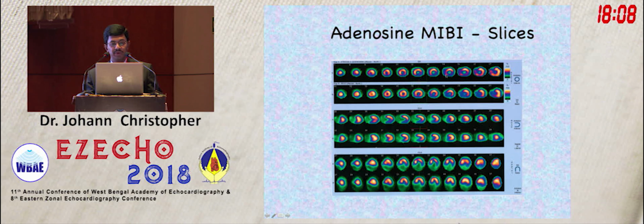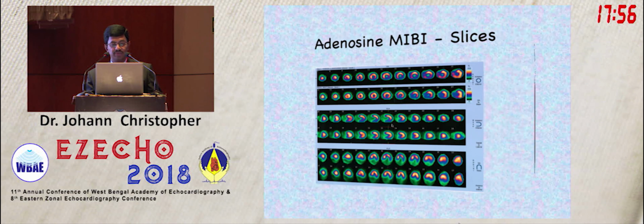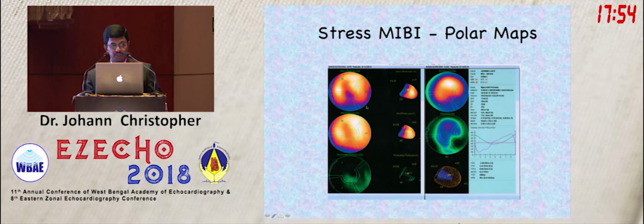And if you look at the images here, you can see that there is a significant perfusion defect here, both in the stress, in the right coronary, in the circ, and also here in the LAD territory. So all three vessels, and this is very nicely brought out in the polar plot, where you have ischemia in the circ, ischemia in the right coronary, and in the LAD in the apex. And there is significant improvement on rest, showing that not only the area is viable, but there is significant ischemia in multiple coronary territory.